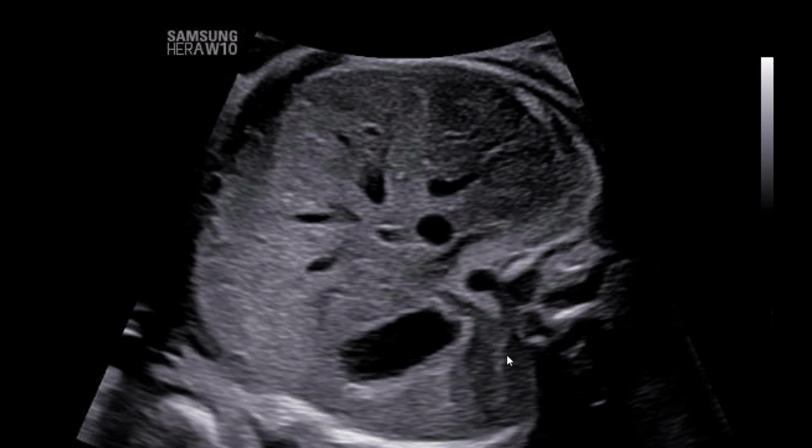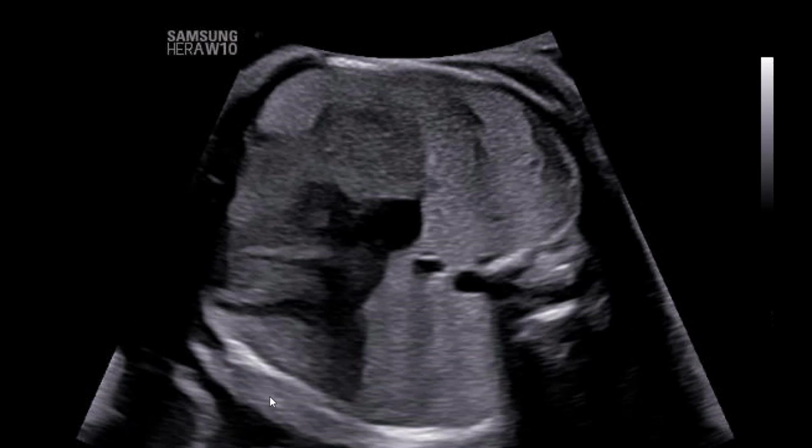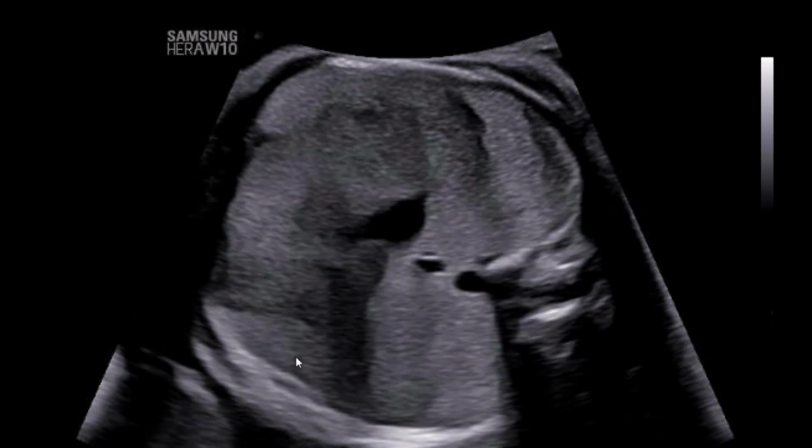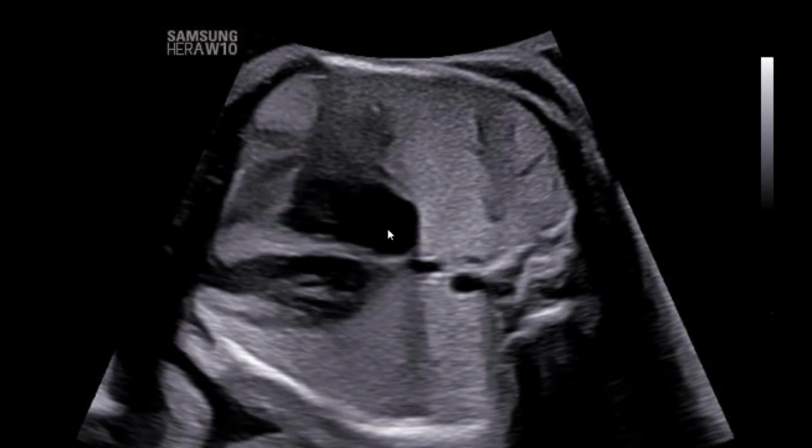and you can see the stomach bubble and the spleen behind the stomach, and then the mass of the liver, which is mostly on the right. There's the IVC, and here is the aorta. And we transition more cephalad on the fetus as we watch the hepatic veins drain the IVC and then drain into the right atrium here.